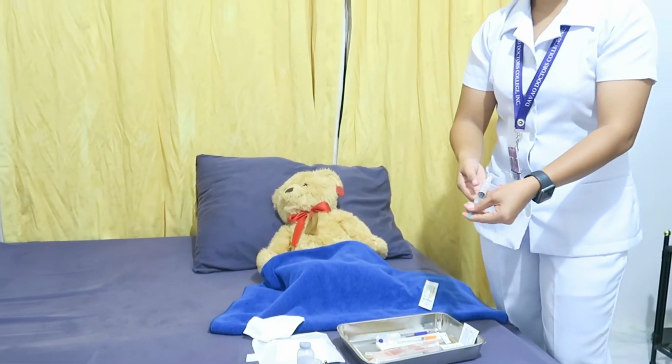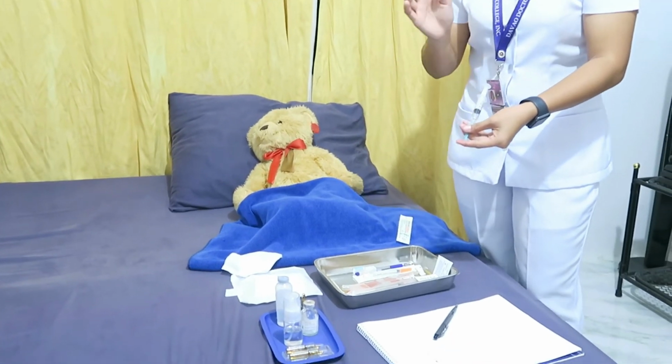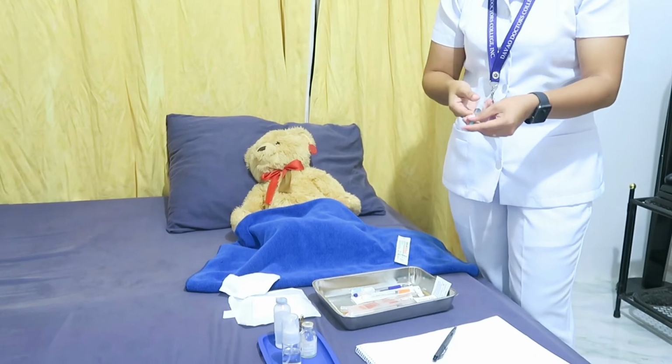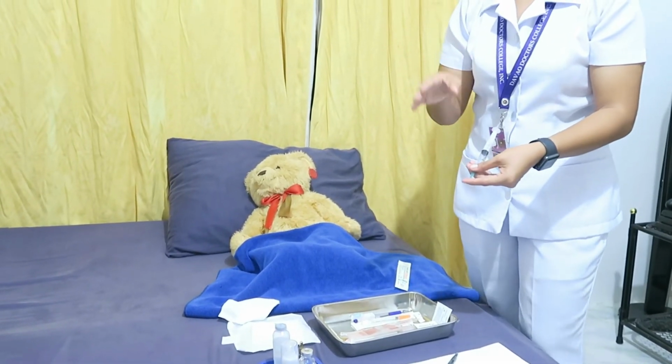Then, after that, follow the 3 checks of administering medication. Read the label on the medication. First is when it is taken from the medication cart. Second, before withdrawing the medication. And the last is after withdrawing the medication.